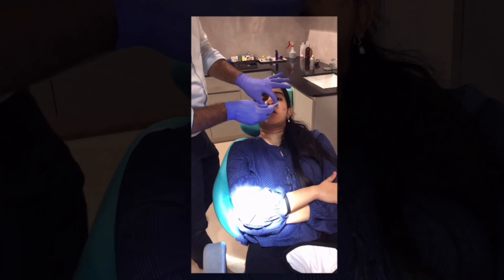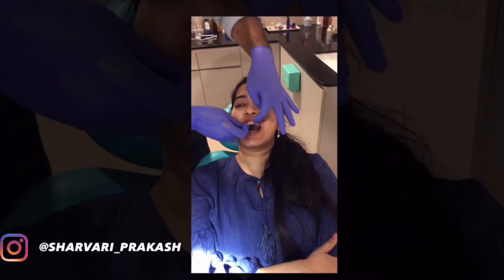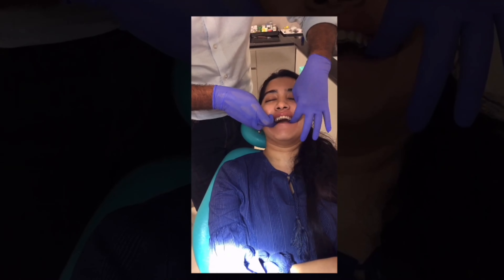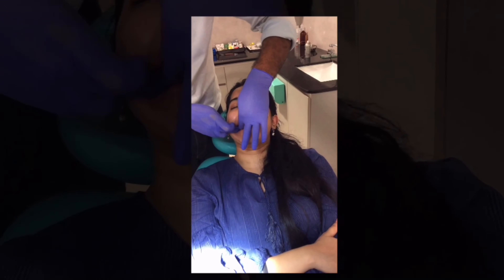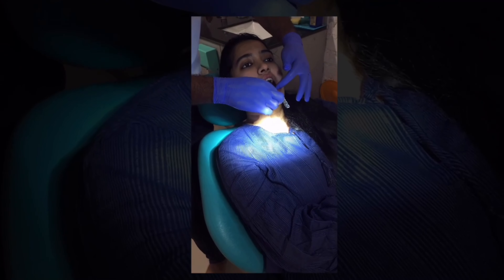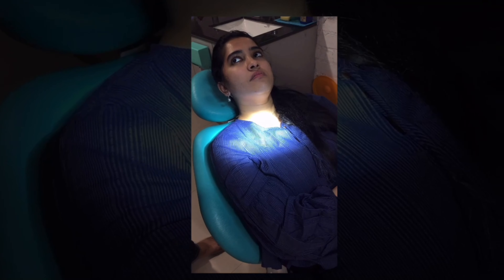While placing it, you just have to align it first. Then you have to push in the back. Can you feel that particular tightness over there? Then on the center, then on the other side. There's a situation in the lower — there's a little more crowding, they're slightly overcrowded in one particular position. That is why I told you there will be some contact points — not areas, but specifically points.